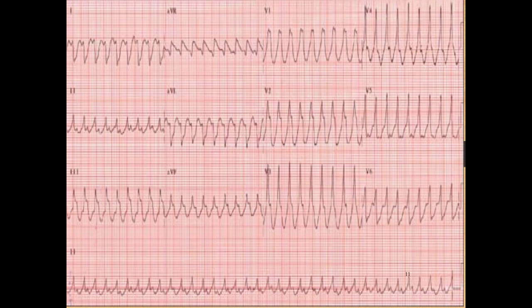What about this one? This one still looks big, wide, nasty, funky, like, oh my lord. So if I looked at lead one, if I pulled that up, it might kind of look like V-Tach. If I pull lead 2 up, it looks funky. I don't really know what that is. So let's take a whole 12 lead. We have a stable patient again.